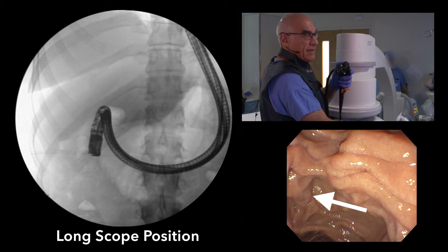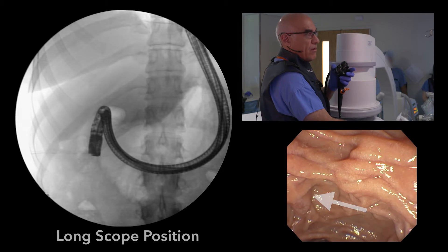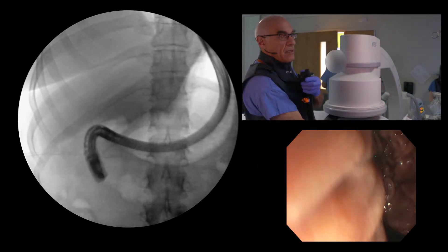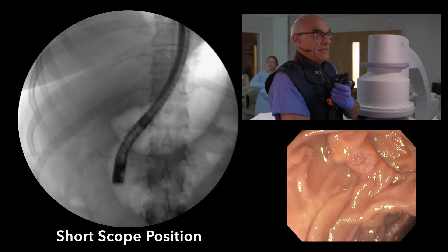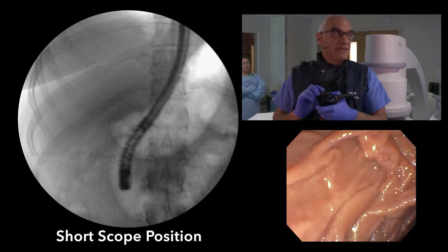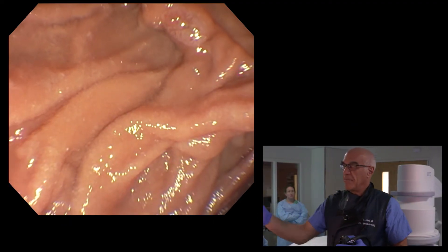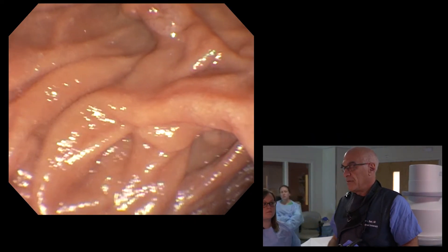I can see the papilla now at the left of the screen, but I'll shorten the scope. You'll see I'll go from long position to short position. And there's the papilla again in short position — you can see the scope is short. I'm looking right up the barrel of the papilla. Because the patient is supine, I'm looking at my secondary monitor, my back is to the patient, and I'm ready to attempt cannulation.